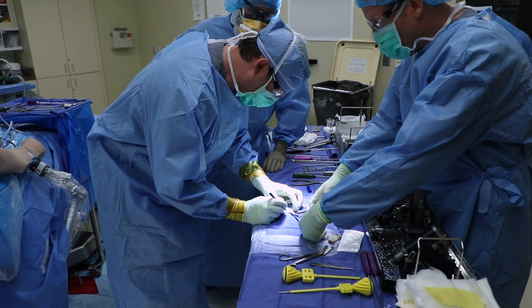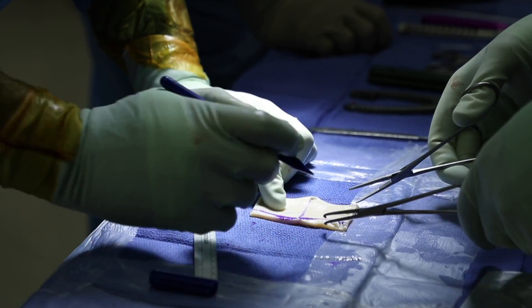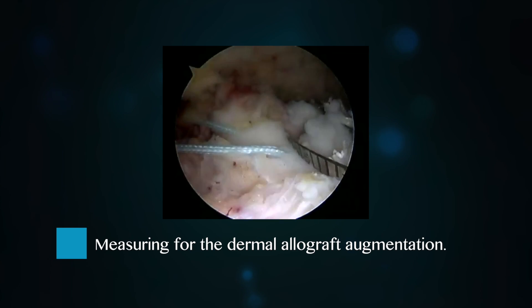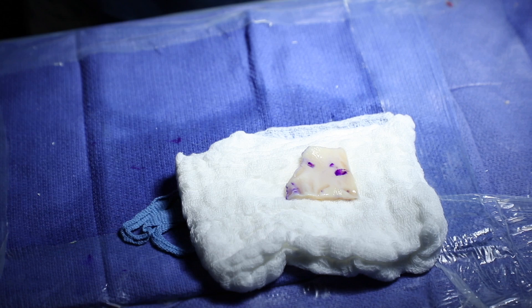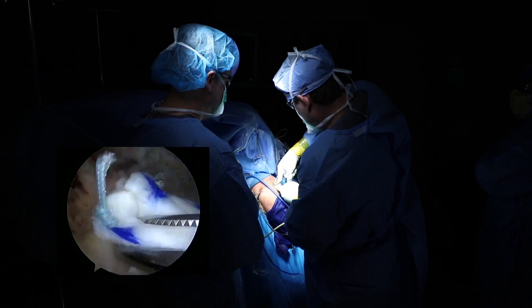What we'll do is craft a patch on the back table. The patch is made of cadaveric skin, so it's thick enough to really give good bulk to the tendon. We'll measure it and size the patch, and then put that patch in right over the rotator cuff repair.